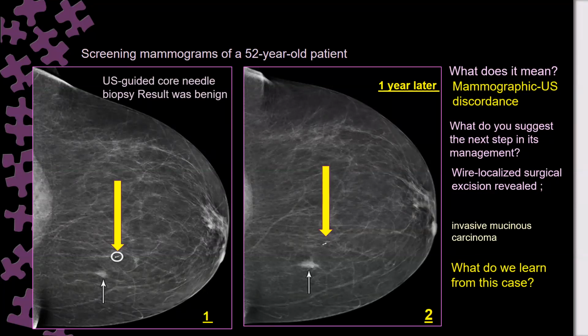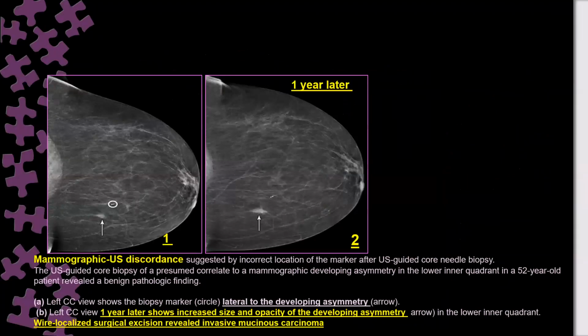And from the start, they have to go again and re-biopsy the patient. We have to be sure. Yes, they already imaged after biopsy. We have to make sure the biopsy had been taken from the right side.